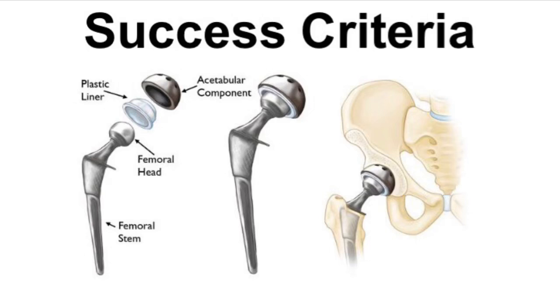To design a functional porous stem, we need to assess which kind of porous structure provided the best results, i.e., in the stress and strain of the bone, similar to healthy people, and the stem is strong enough to bear loading. This is all done through biomechanical analysis. The loading which I'll be using is 2000 newtons, due to the weight of an average human person.